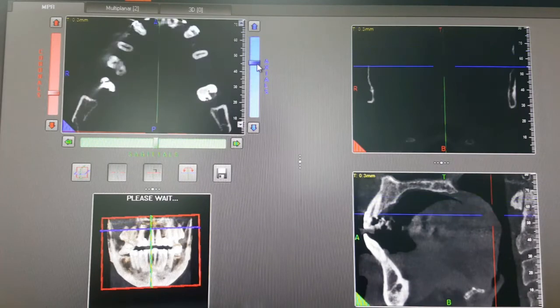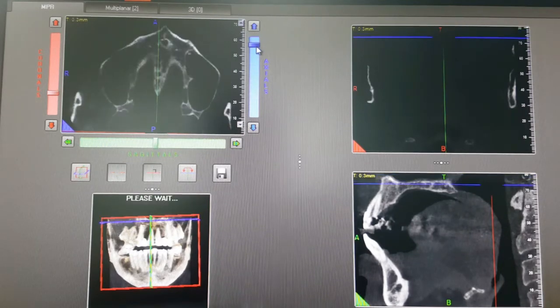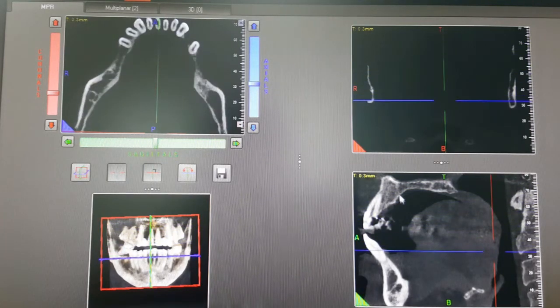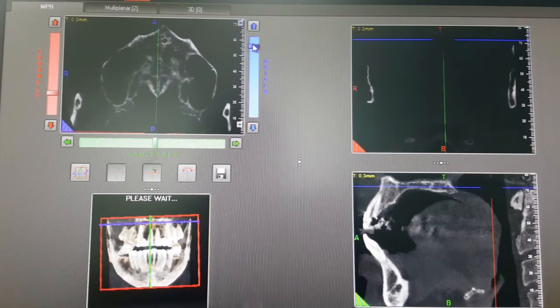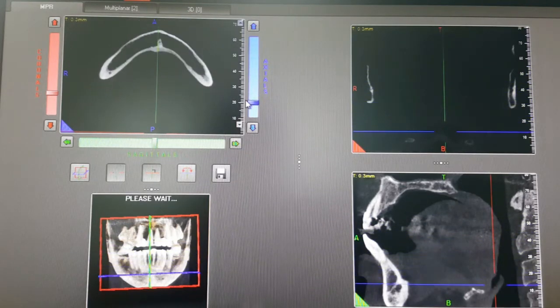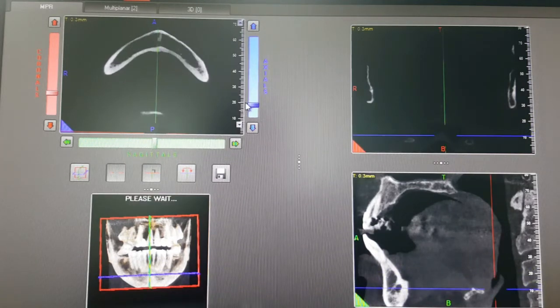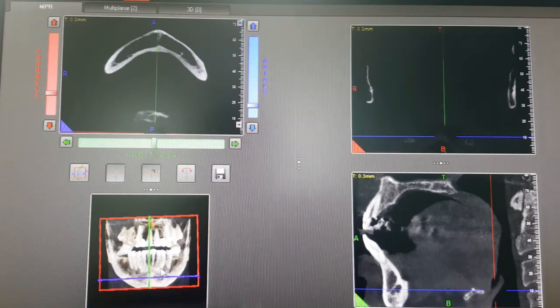The next is the axial view, which can be changed from here. As you can view in the coronal and the sagittal, the axial means going from the top of the head down. First comes the maxilla, then the maxillary teeth, then you come down and view the mandible and mandibular teeth. Then in this region, if you look at the 3D image, you are near the mental foramen region — this is the mental foramen here. You will be able to see the mental foramen in all the views: in the 3D, in the sagittal, and in the axial.